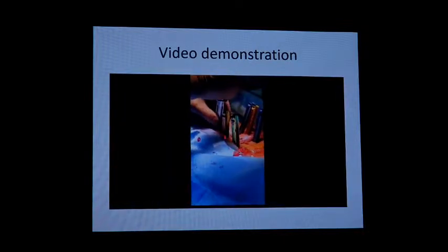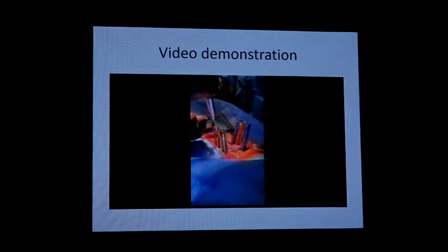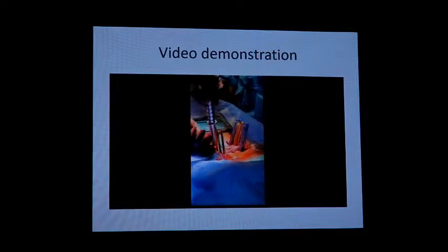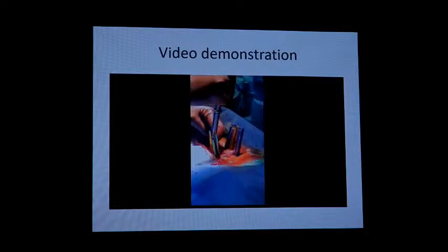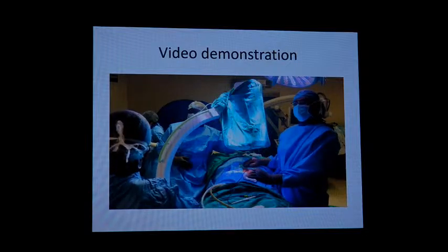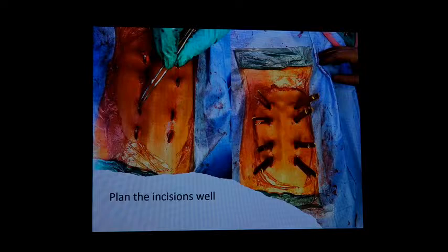See how the screws are in line. You have to mark your incisions well. This step shows how to break these pillars, and it is fairly simple to take it out. So it's always important to mark your incisions in a serial way so that they are all in line, so that you don't have difficulty in placing the rods. Sometimes if you are not paying attention, you can have one incision here, one incision there, then you will have difficulty in inserting your rod.